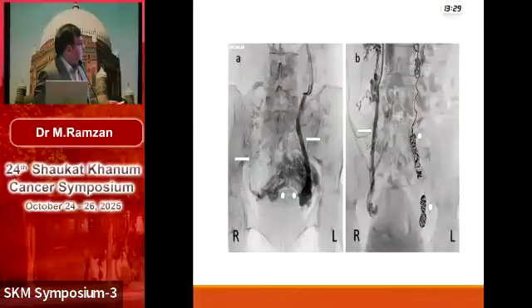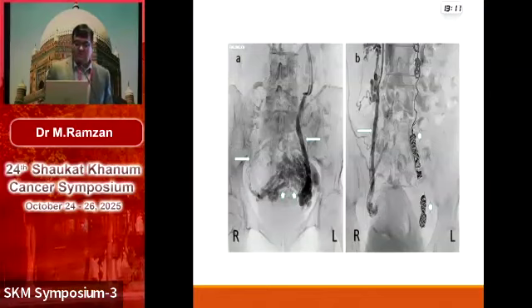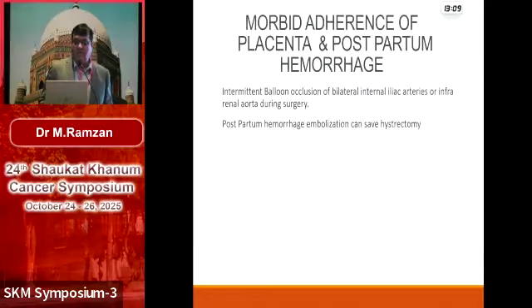So this is the ovarian vein, and all these coils are put in. You can even inject the glue, and you can treat the pelvic varices from the internal iliacs, or the vulval varices. They sometimes cause a lot of discomfort. Using embolization materials like STS is really good.